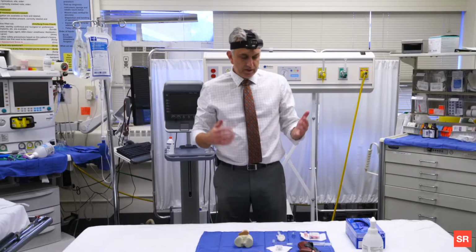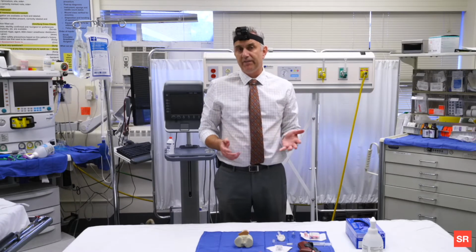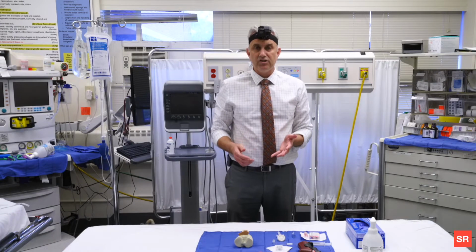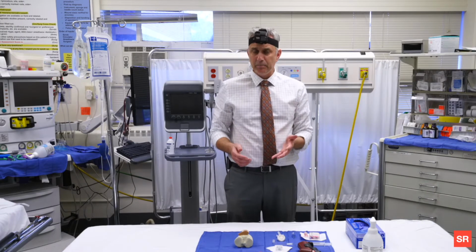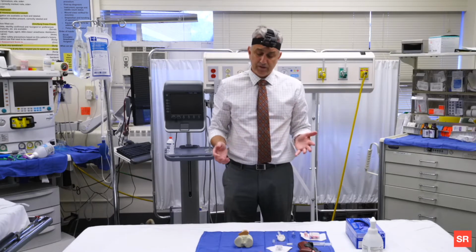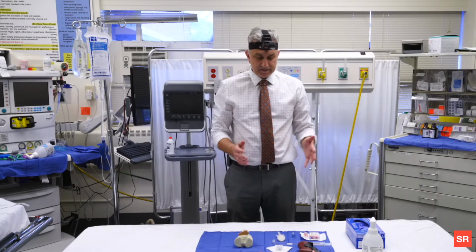Okay, so I am going to talk with the parents and make sure that I've discussed the risks and the benefits. The benefits are that I'm going to be able to give IV fluids and medications through this line once it's placed. The risks might be damage to the bone, bleeding, infection, but they're very rare. So now I've done the risks and benefits. I have my equipment here.